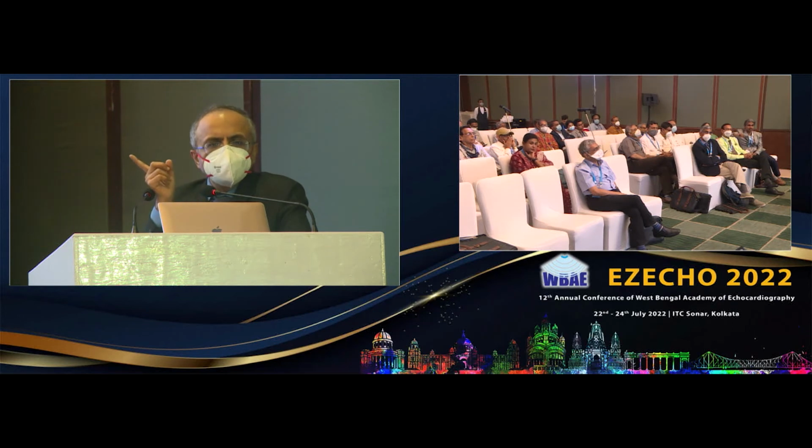That means we are multiplying this percentage by the patient's myocardial mass per meter square, and that is much more reproducible and a much more powerful indicator of long term outcomes. So normal is less than around 10 ml per meter square. Anything above 10 ml per meter square is generally called iECV expansion.